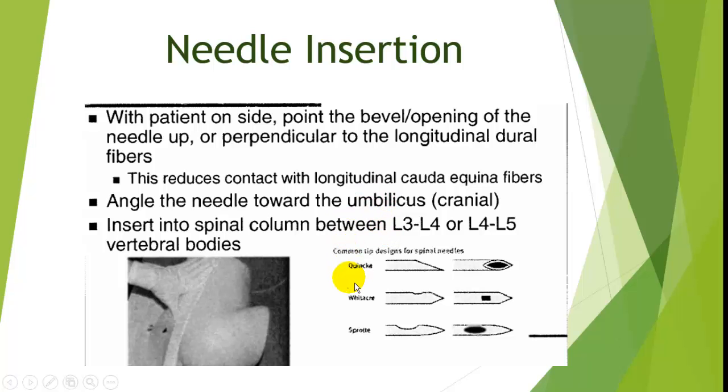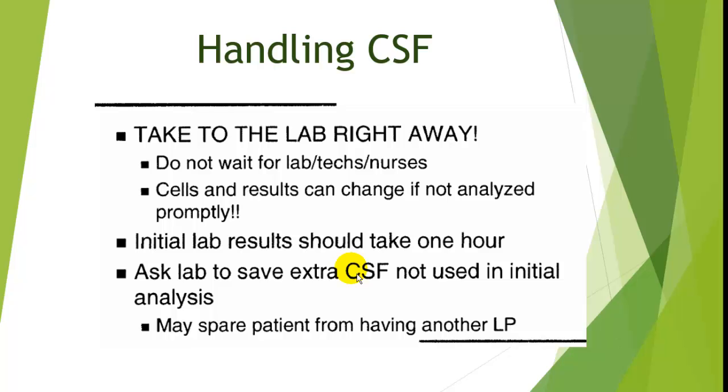Again, these are the ways that we insert the needle. It would be interesting to get a hold of these Sprotte needles, because you see they don't have the opening at the very tip, so that this non-opened end can hopefully separate the dural fibers and cause less trauma, so that it would also reduce the incidence of a post-LP headache.